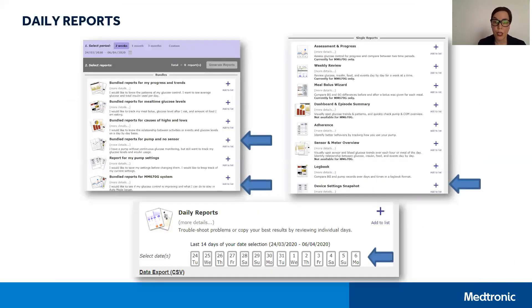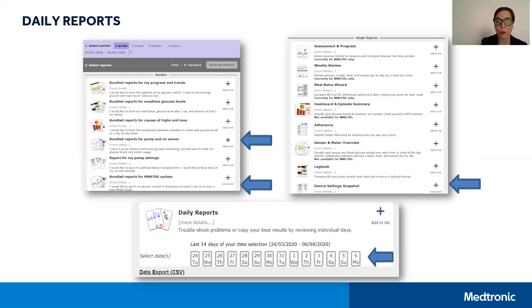If you prefer to look at each individual day outlined in a linear fashion, you may want to look at the daily reports. At the bottom of the single reports, you'll find the addition of the daily reports. There is a button for each day you might want to view — highlight that button by clicking on it, then add those reports to your list and hit Generate Reports.